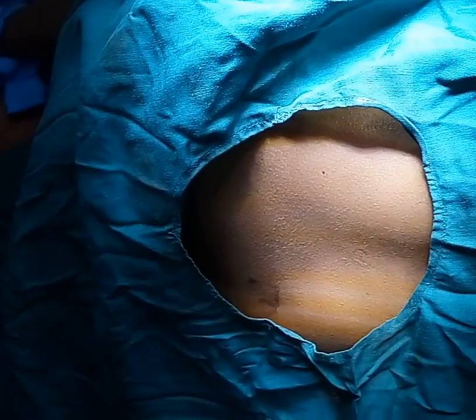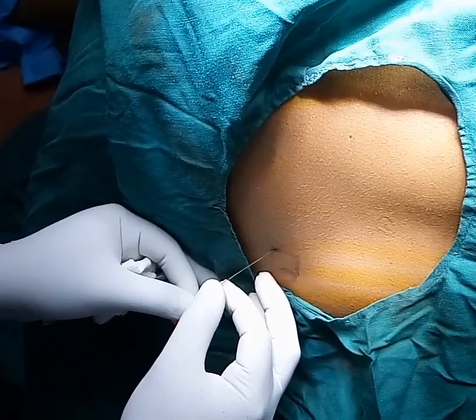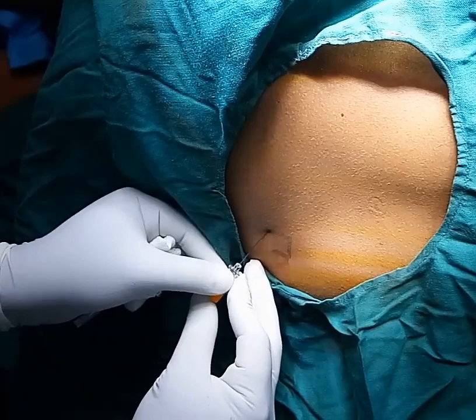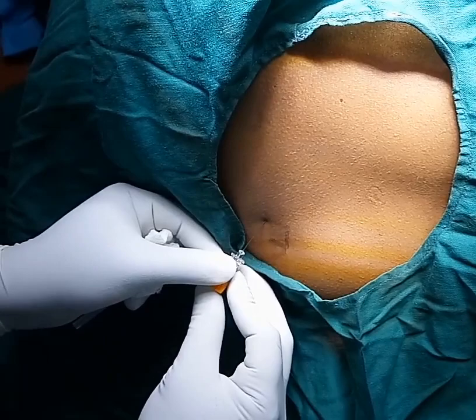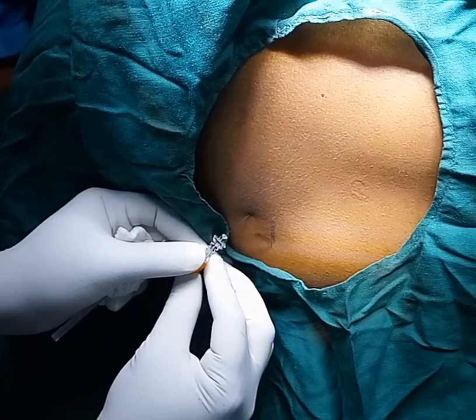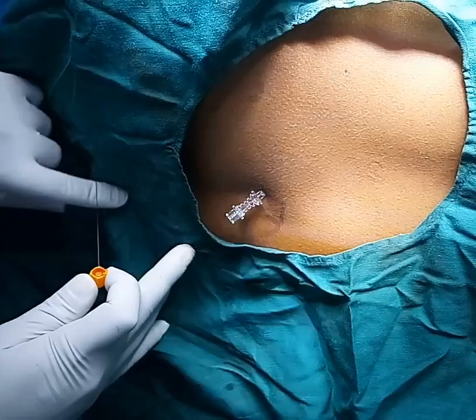I am not editing my video, so let's see how it goes. I am going in a cephalo-medial direction. It hits bone — that will be either the sacrum — and redirecting medially again hits bone, further medially again bone, and now going in a cephalad direction. I will enter into the thecal space with a pop, and you can see this.